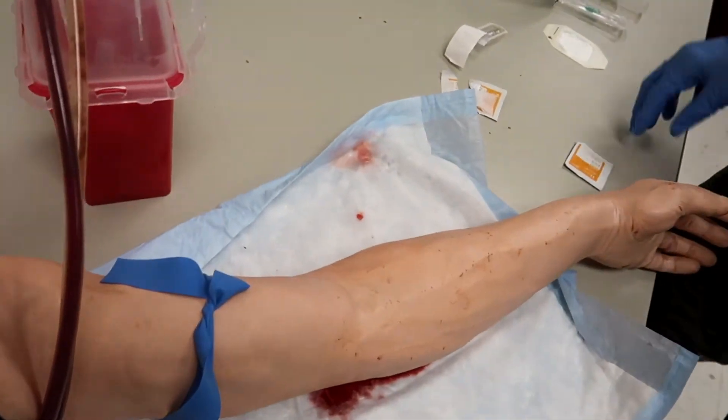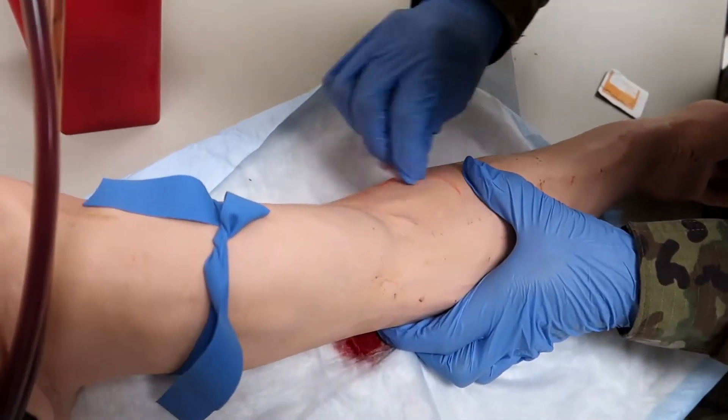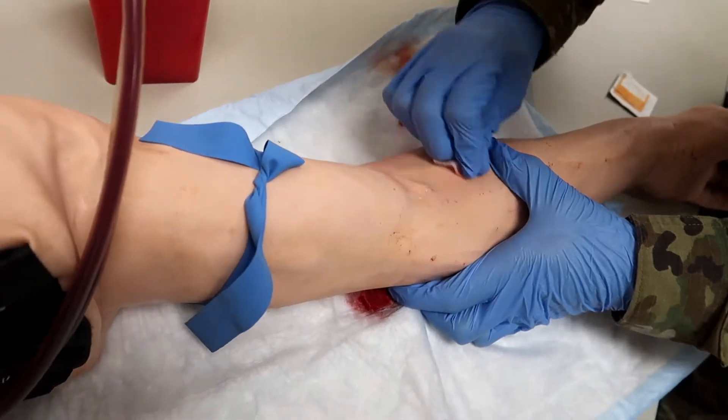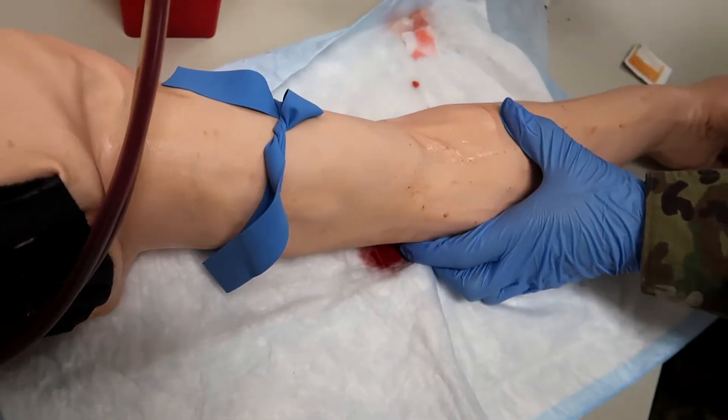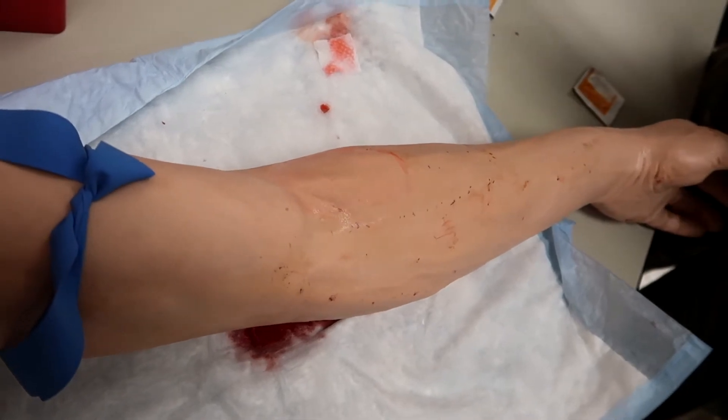Step four is clean the site with an alcohol wipe and then uncap your needle. This dummy arm may or may not bleed just because it's kind of old. But you'll know you get the stick once you see that return of red in the flash.